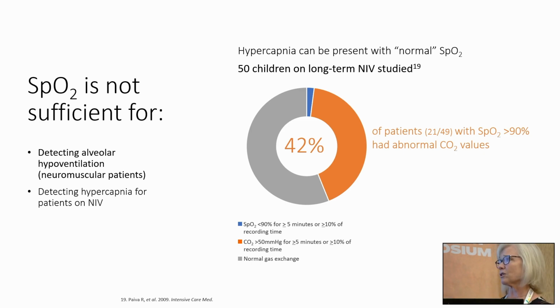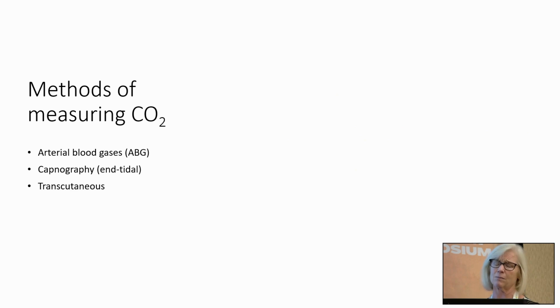So what this study told us was that the oxygenation does not reflect the ventilation, and we know that's true with a lot of cases. A lot of times it goes hand in hand, but a lot of times it does not.